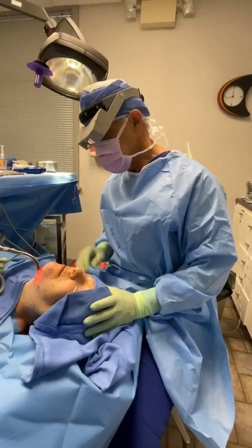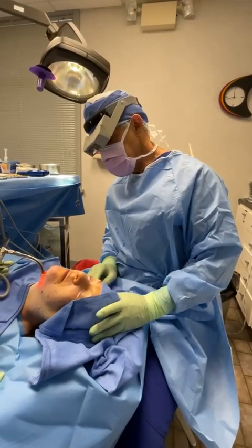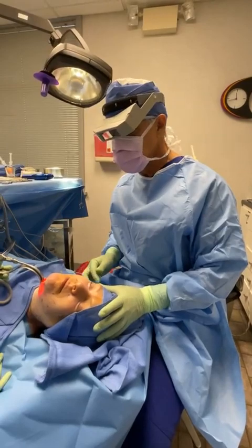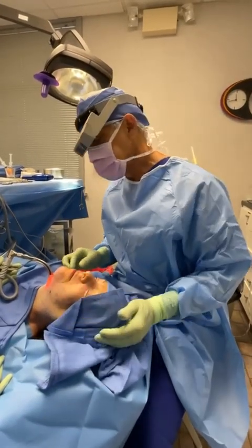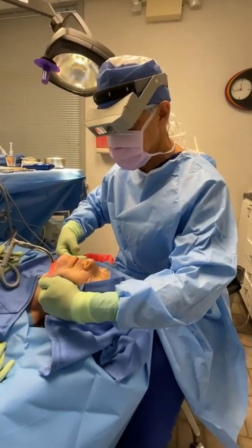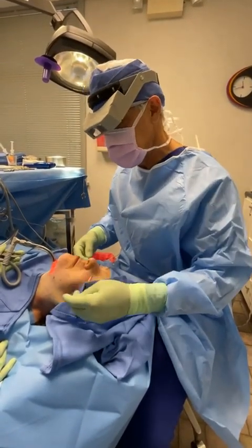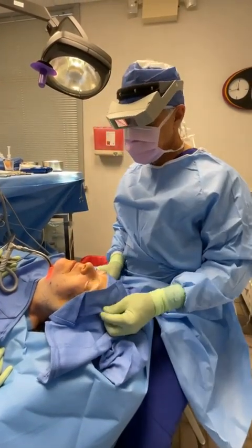So far I've done the right side. I've made some incisions in front of the ear and up into the scalp a little bit, behind the ear a little bit. I've also suctioned down the jowls — fat accumulates on the outside of the smile lines, and then the inside of the smile lines towards the mouth are typically a little bit fat deficient.